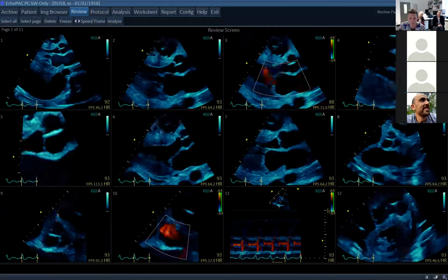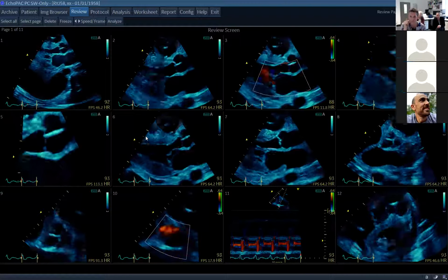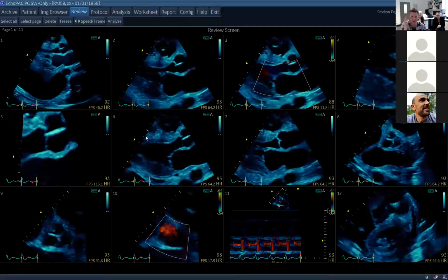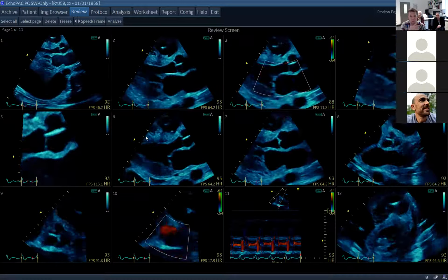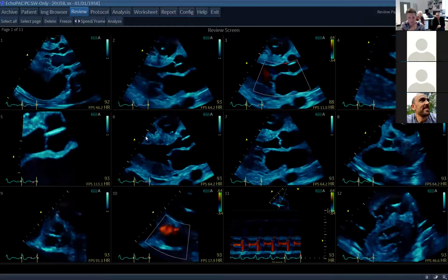Okay. And then particularly that it's the regional wall motion abnormalities, the restrictive filling, the pericardial effusions can be there, the thick myocardium, the very thick myocardium with the speckled appearance. And the speckled appearance is less when we start using harmonic imaging, but we still talk about it.